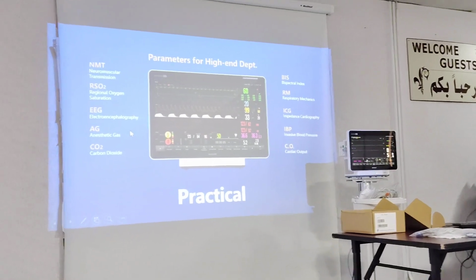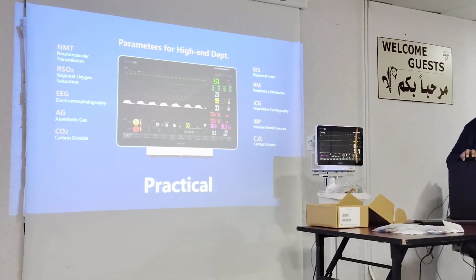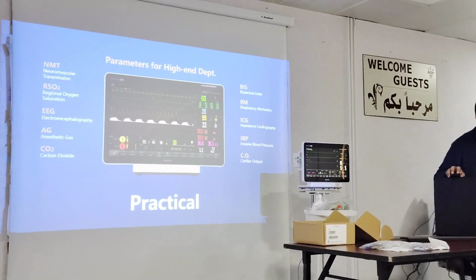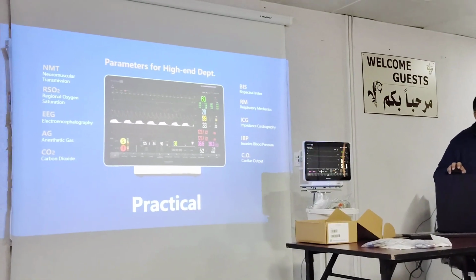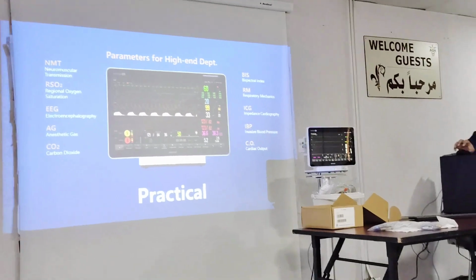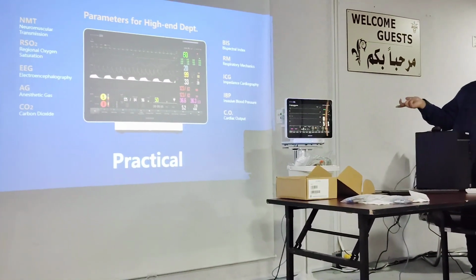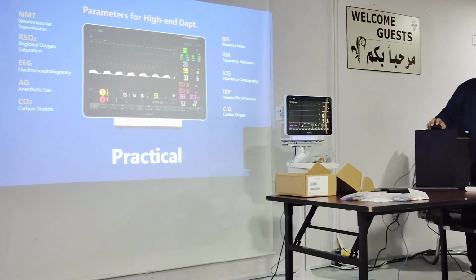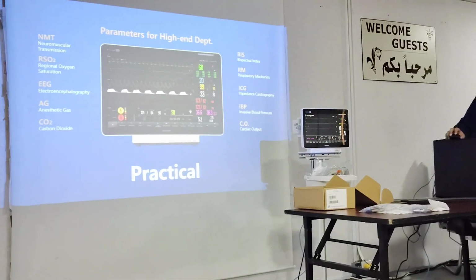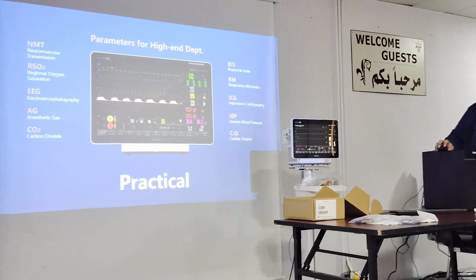How about the electrodes we want to use? The electrodes that we are using for the EEG. Yeah, there is available also. It's actually a cable. There is no electrode. You just put the gel. Yes, so it's a cap. I will show you. There are no disposable electrodes, is what I'm saying.